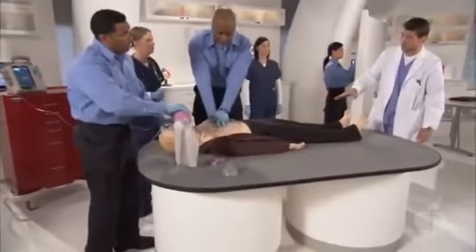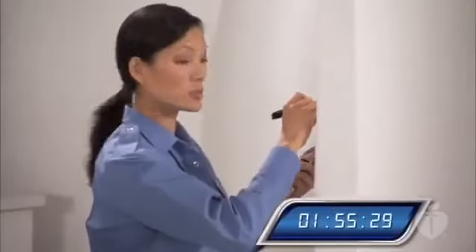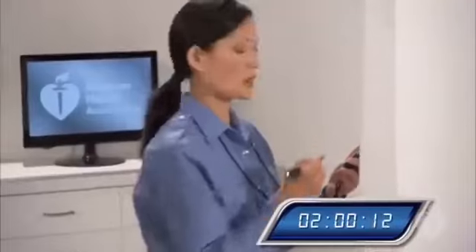Okay, great. We're going to continue chest compressions at a rate of at least 100 beats per minute. Let's give 1 breath every 6 to 8 seconds and avoid excessive ventilation. How long since our last shock? It's almost 2 minutes. Okay, let's get ready to switch compressors. We're going to stop and analyze. 2 minutes. Okay, let's analyze.